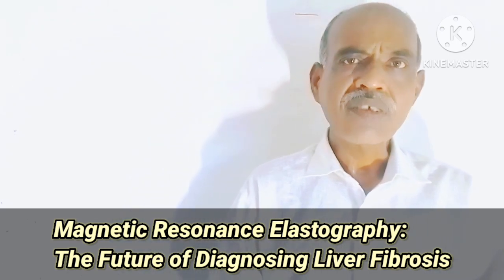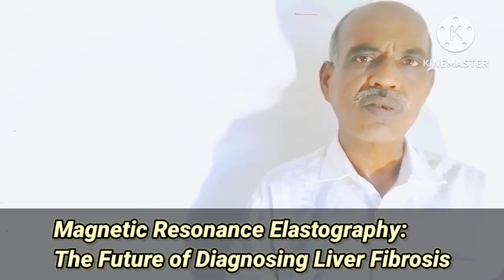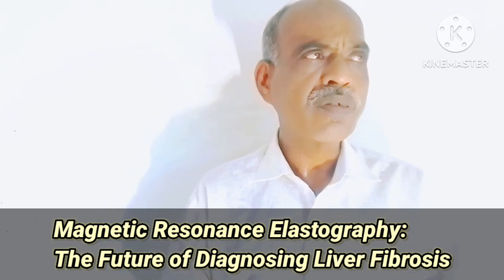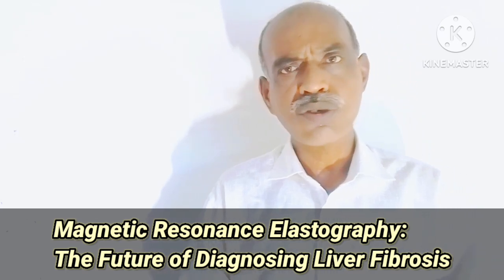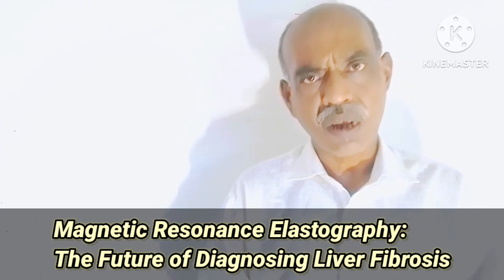Okay. Next is why only MRI is not being used to measure the stiffness for liver fibrosis. Why MRI alone is not used? Because you know that MRI can produce very high resolution images. Accurate anatomical structures can be produced by using MRI.